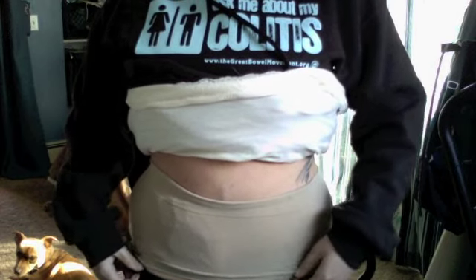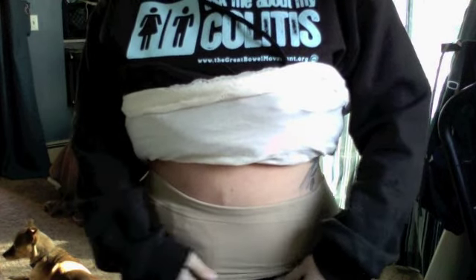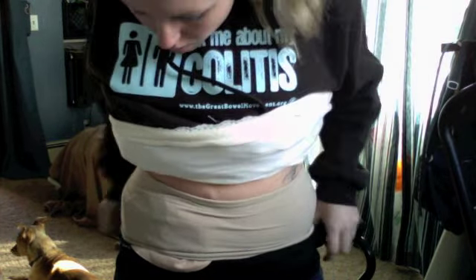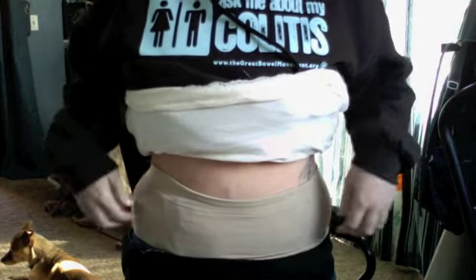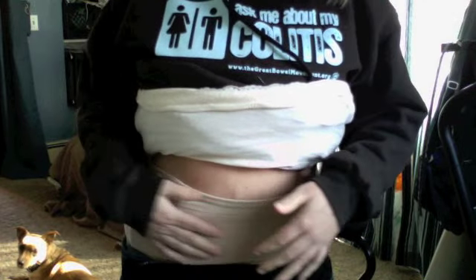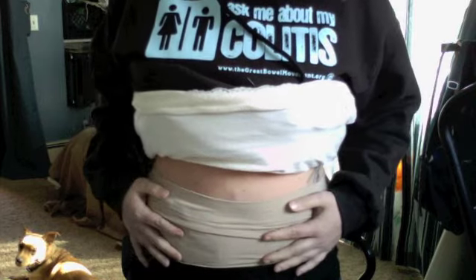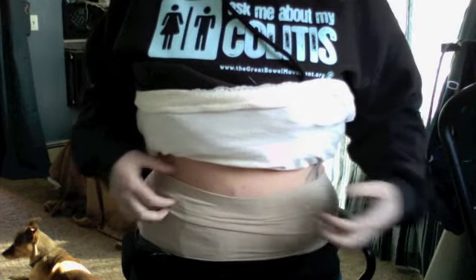I should have put on a pair of regular jeans, but I didn't really want to take my pants off in front of the world. So pretend these are my regular jeans. Regular jeans, okay? Belly band here, bag here, same thing. Supportive, keeps everything tight to your body, and you can't tell that you're wearing it.